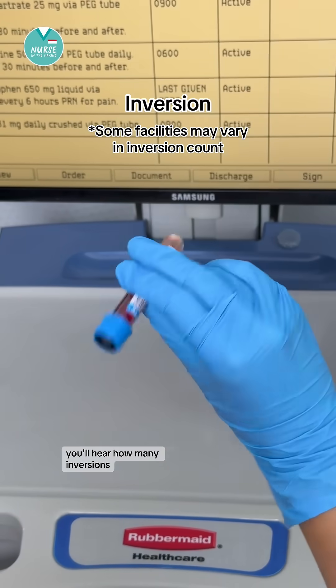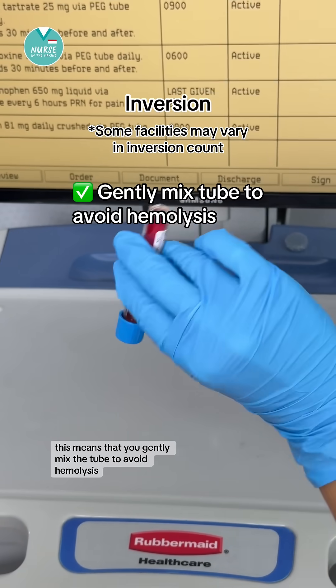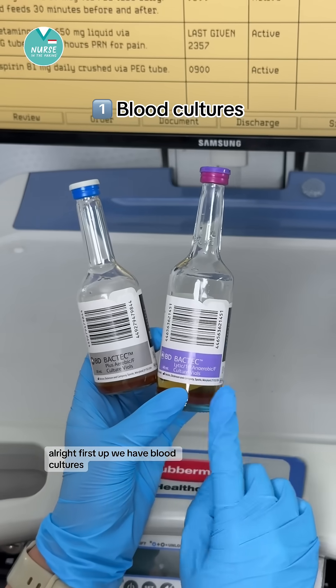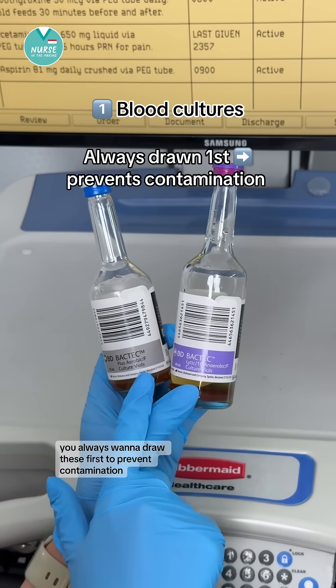For each tube, you'll hear how many inversions. This means that you gently mix the tube to avoid hemolysis, but inversion does not mean shaking the tube. First up, we have blood cultures. You always want to draw these first to prevent contamination.